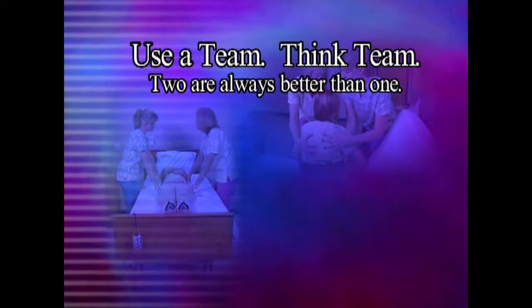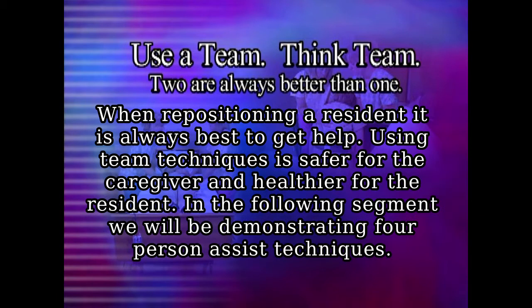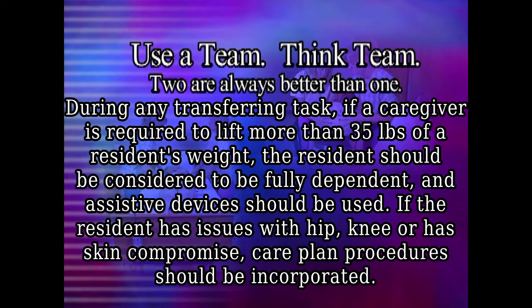Use a team. Think team. Two are always better than one. In the following segment, we will be demonstrating four-person assist techniques. During any transferring task, if a caregiver is required to lift more than 35 pounds of a resident's weight, the resident should be considered to be fully dependent and assistive devices should be used. If the resident has issues with hip, knee, or has skin compromise, care plan procedures should be incorporated.